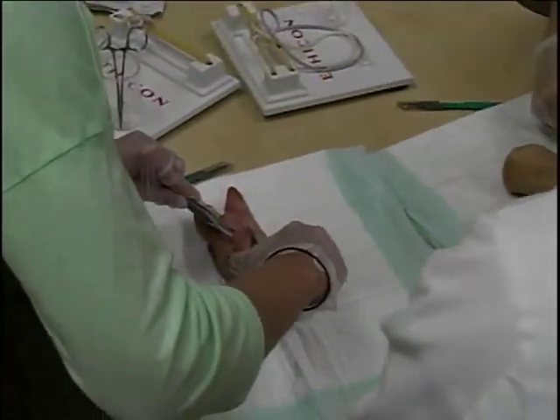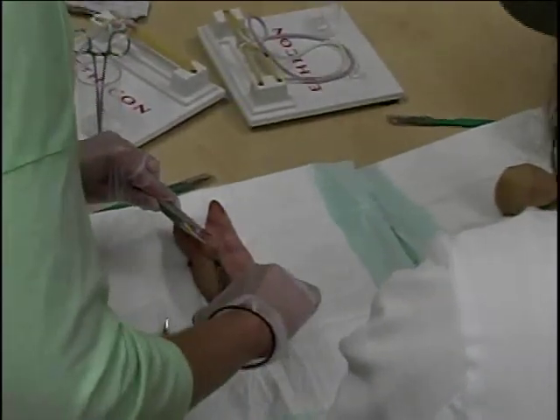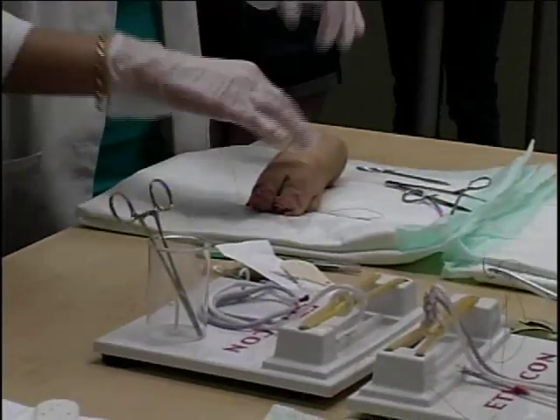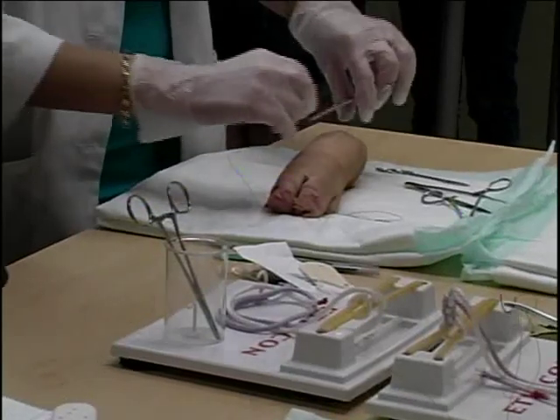Today we use pig's feet to simulate for medical students the way that they would repair a laceration from a trauma in the emergency room, or in surgery after they've performed a surgery. They get to use different techniques, different types of suture, be familiar with that, and actually learn for the first time the intricacies and details of suturing the skin together, how to make it look good, and minimize the scarring.